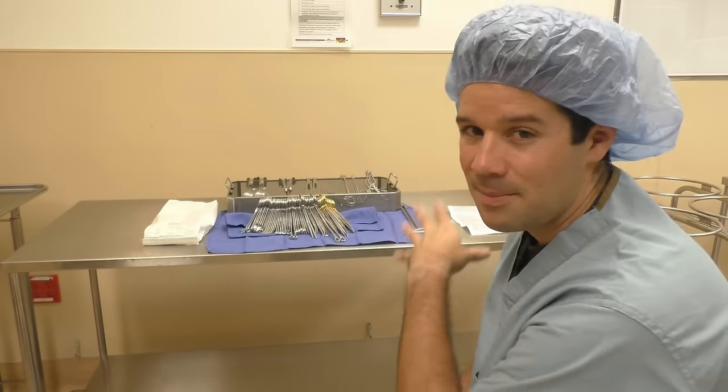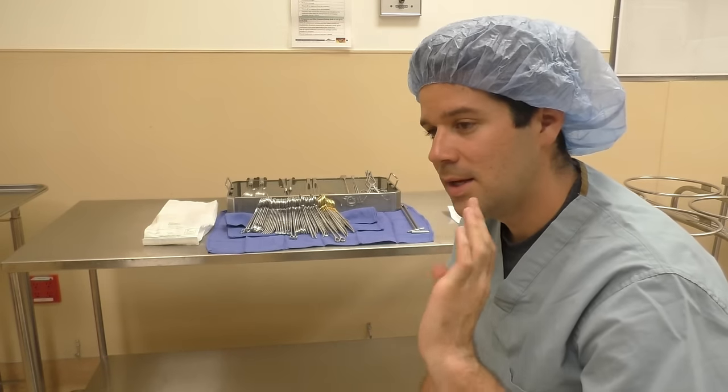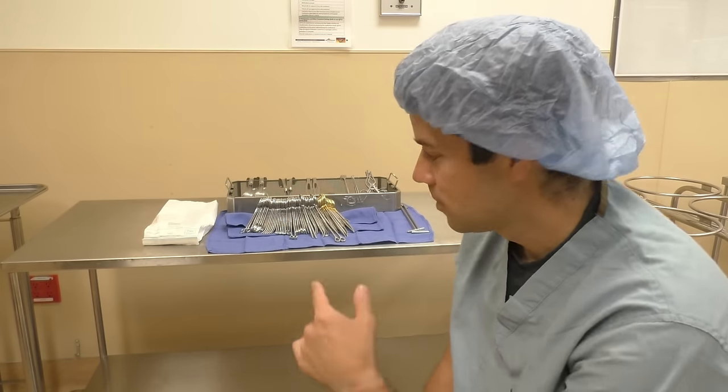There's a lot of applications for this minor tray to be used that you don't necessarily need some of the bigger trays with much more instruments and bigger retractors and stuff like that. So, let's go through it.